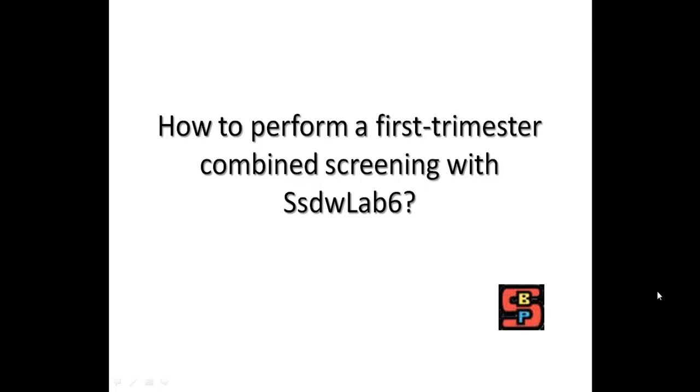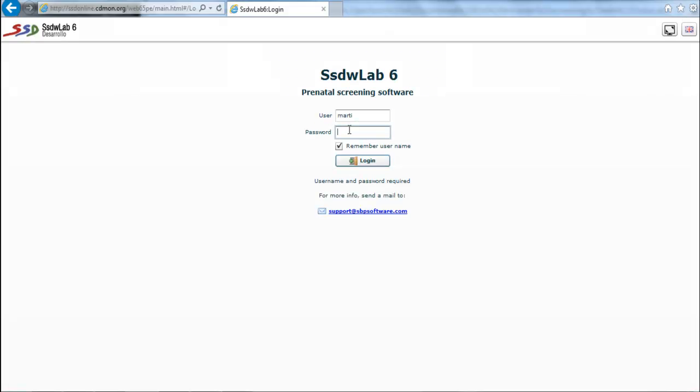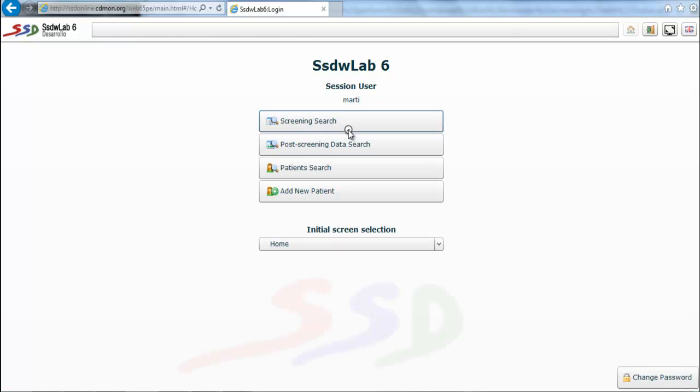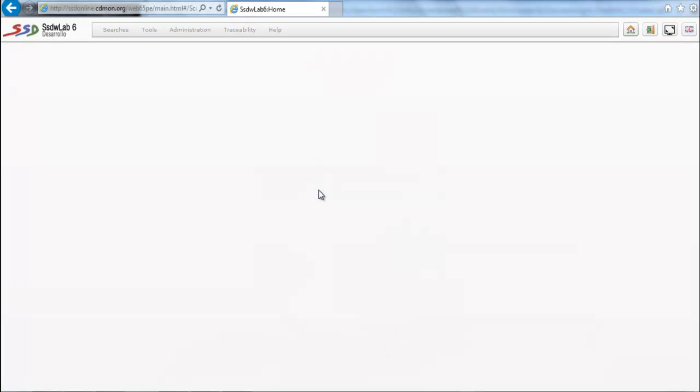Let's see how to perform a combined first trimester screening with SSDWLAB6. We introduce our ID and password to enter the web. It will appear several options and we choose add new patient.